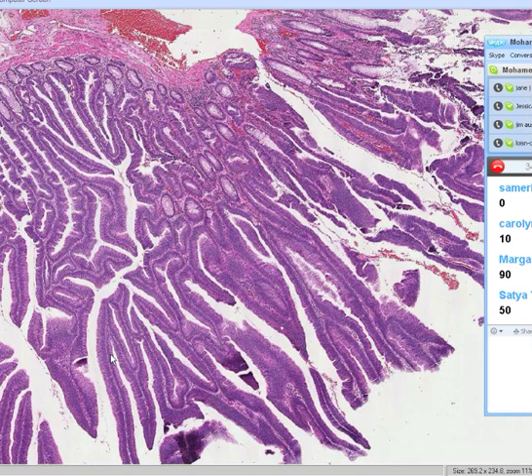So we'll move on to the next case. Did everybody hear me and see pretty well on this case? I'm still kind of curious because of our original problems. So I'm hearing yes, yes, yes, yes, yes. Okay, let's go to the next case. This is another drop dead easy one, folks.